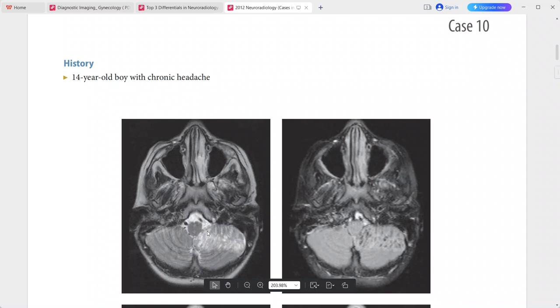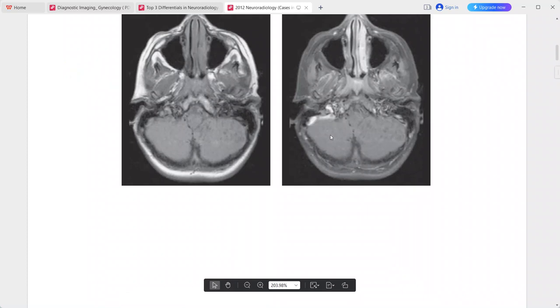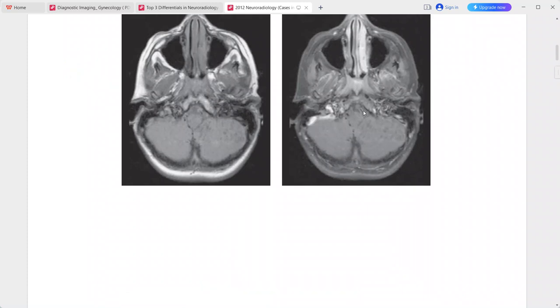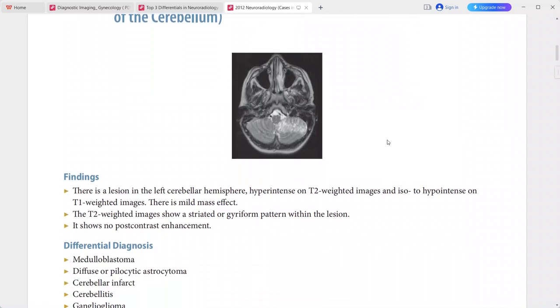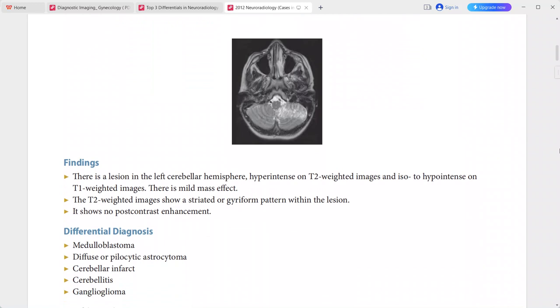There is mild mass effect. T2-weighted images show a striated or gyriform pattern within the lesion. Post-contrast images show no enhancement. This is a case of Lhermitte-Duclos disease, i.e., dysplastic gangliocytoma of the cerebellum. Differentials include medulloblastoma, diffuse or pilocytic astrocytoma, cerebellar infarction, cerebellitis, and ganglioglioma.